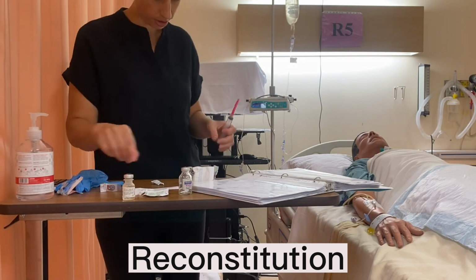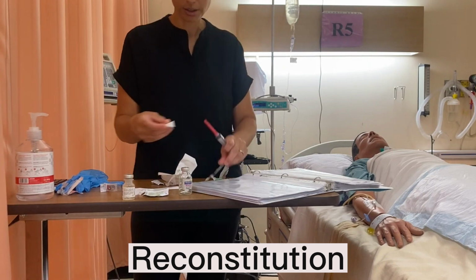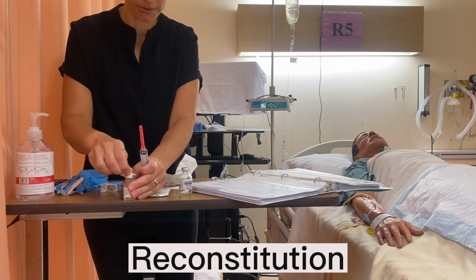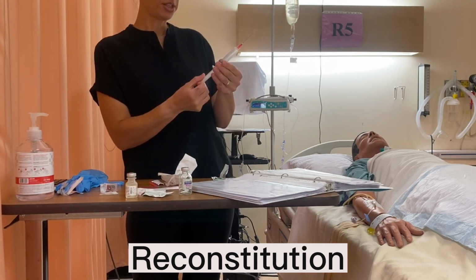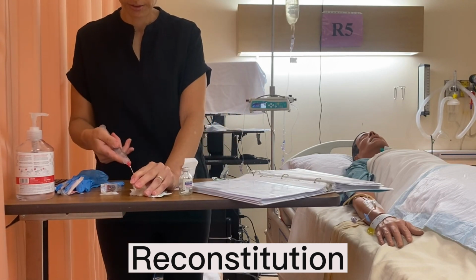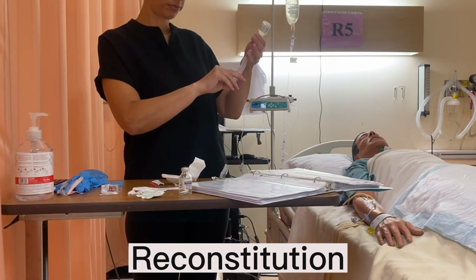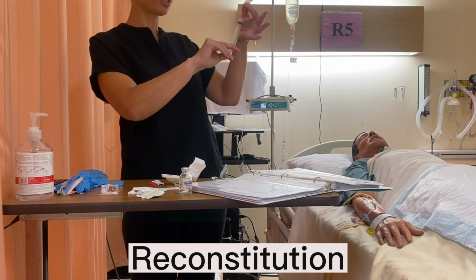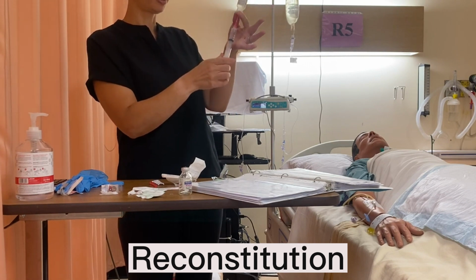Okay. Oh, and the other thing I'll need to do too is swab the other top. So I'm going to grab another alcohol swab, swab the top there, 30 seconds, dry for 15. And I'm going to instill 10 mls of air. Okay, if you get too much pressure, don't push it because the top can fly off. Just stop pushing in the air and then allow it to fill.